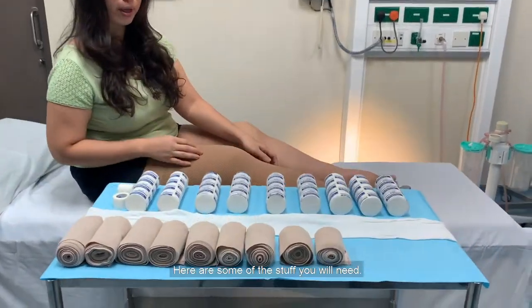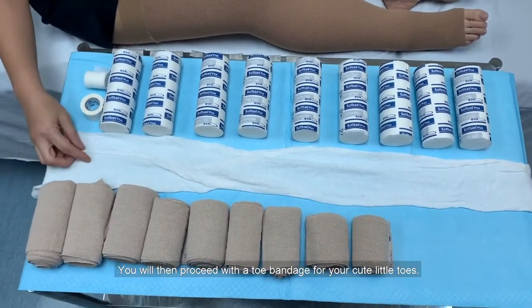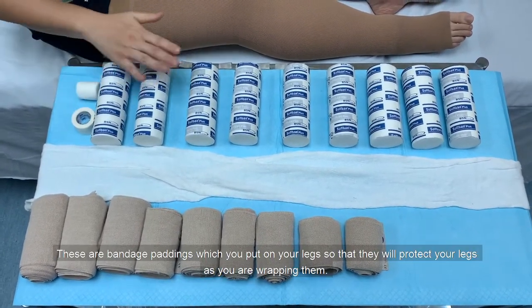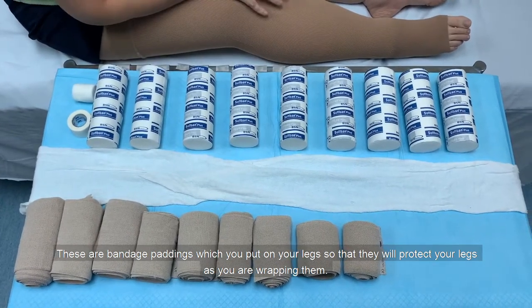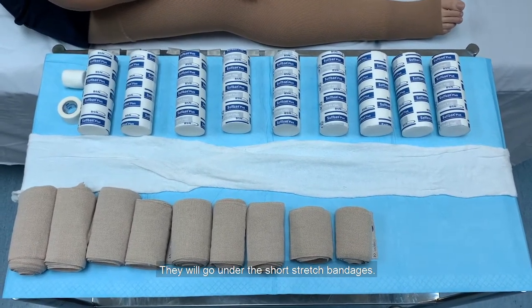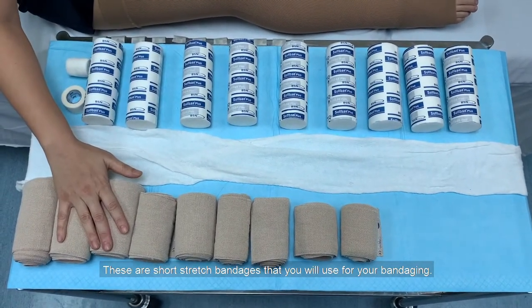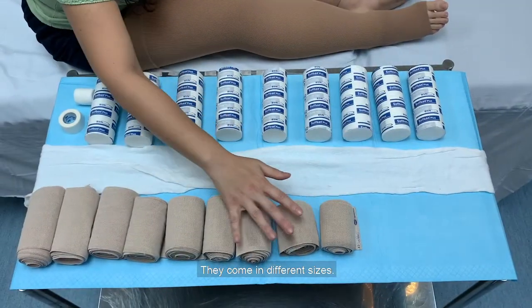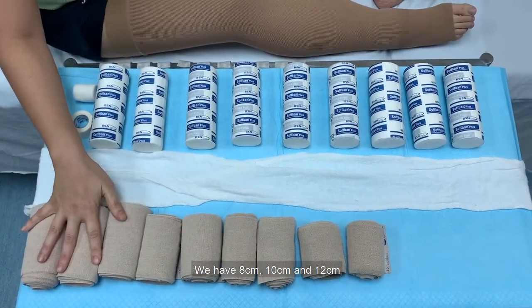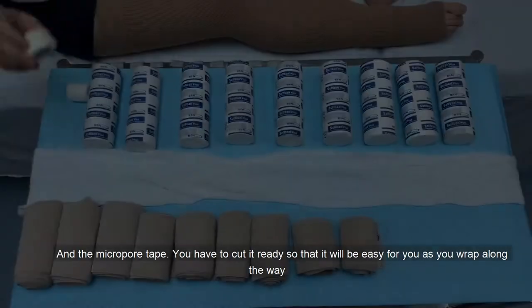Here are some of the things you'll need. You'll need a bandage stocking — this is the first thing to go onto your legs. You'll then need a toe bandage for your toes. These are bandage paddings which you put on your legs to protect them as you are wrapping. They will go under the short stretch bandages. These short stretch bandages come in different sizes: 8cm, 10cm, and 12cm, for the different parts of the leg.